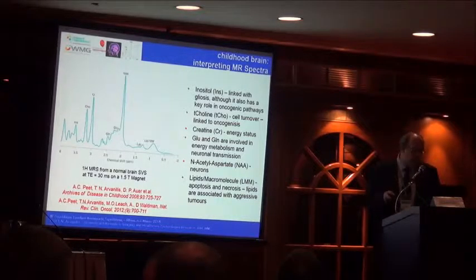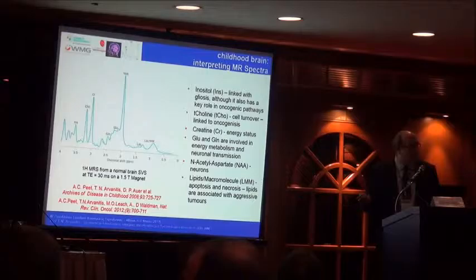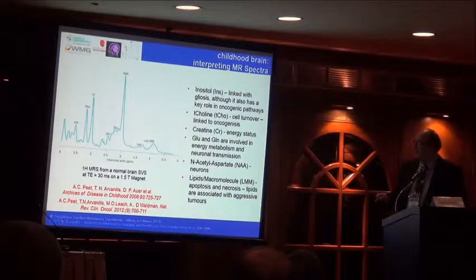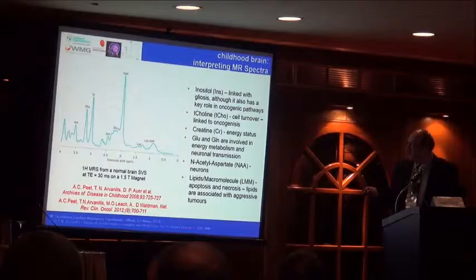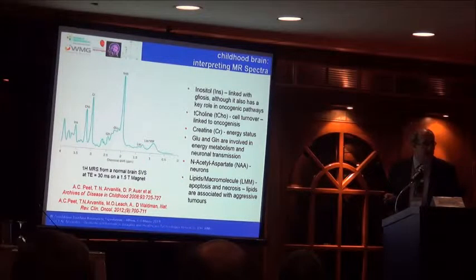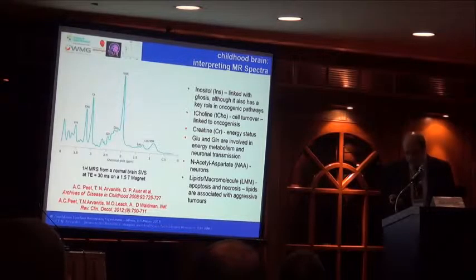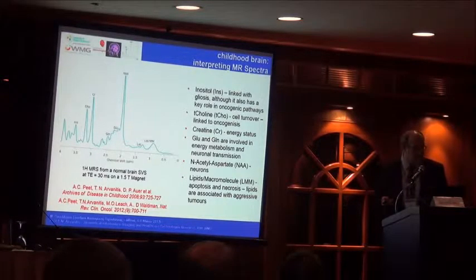Of course, glutamine and glutamate tell us a little bit about energy metabolism. NAA tells us about the health of our neurons. It should be the highest metabolite in the spectrum. And lipids are really, really bad because they tell us about aggressiveness of tumors. So we have learned a lot from spectroscopy.